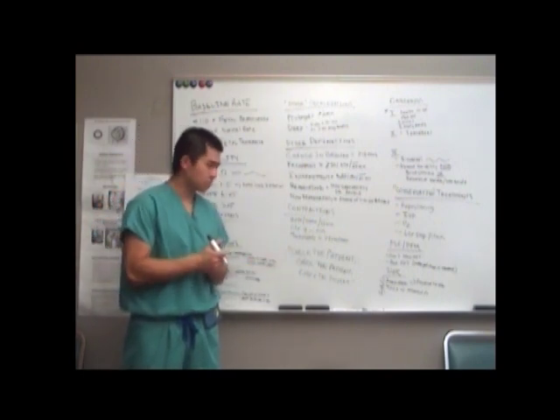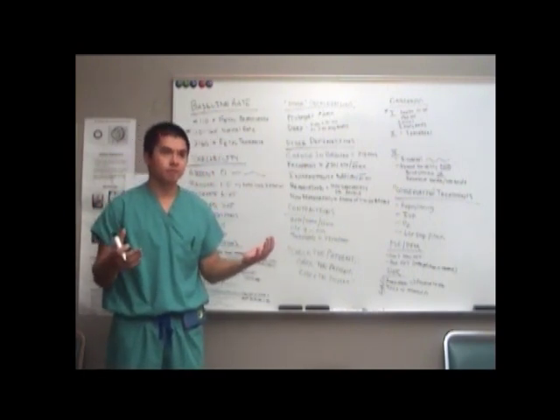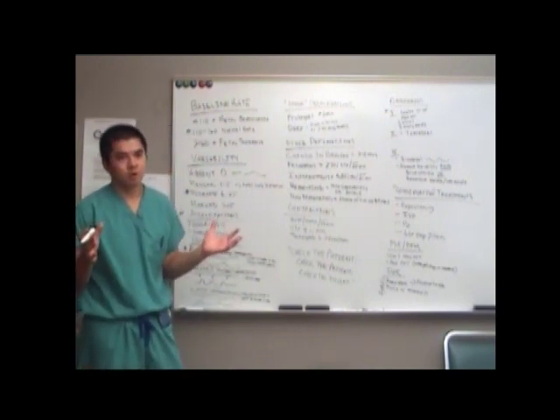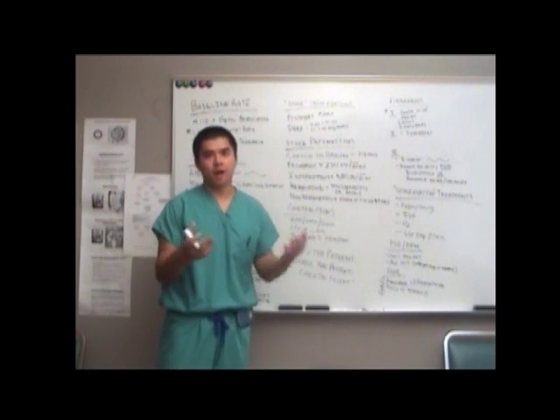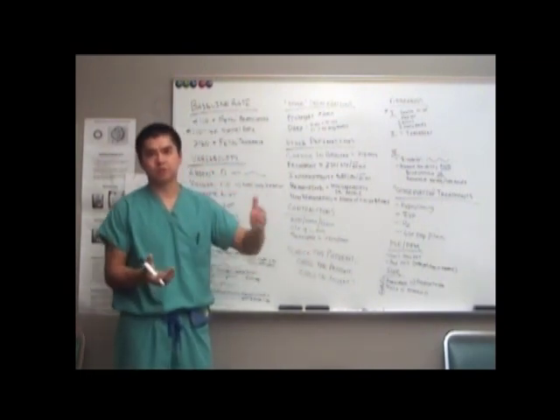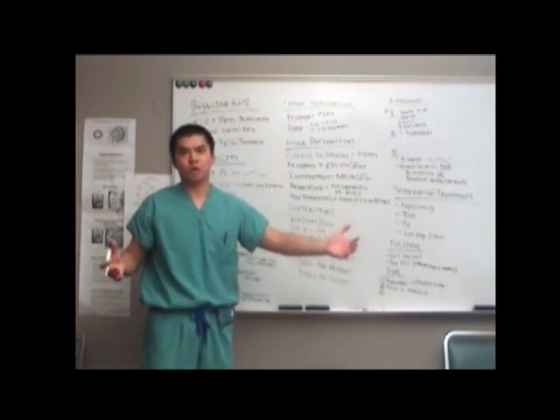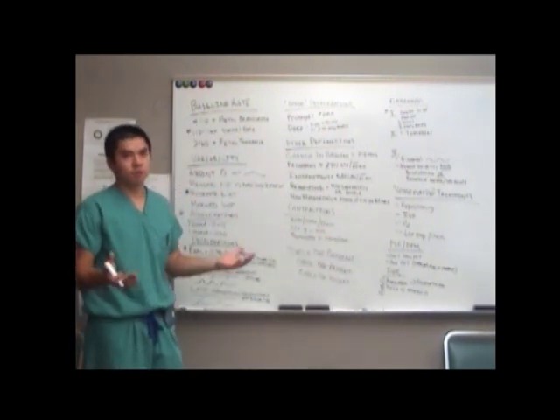No, it doesn't matter. Are they adequate based on their contractions? Well, you don't know what their MVUs are, but it doesn't matter. They're adequate by definition because their cervix is changing. So if their cervix is changing, you don't really care where their contractions are, and so they're adequate by definition.